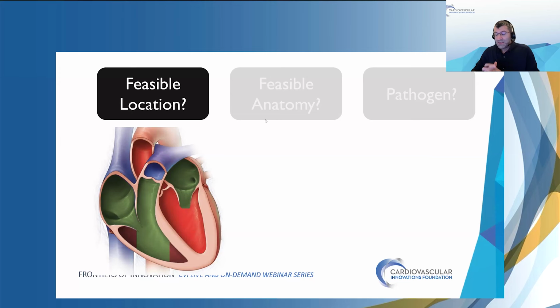Yes, and I would add to that one additional technique, which is actually aspirating on the way back. So sometimes it's hard to get to that subvalvular space in certain situations. So I usually just cross, ramp up the aspiration flows, and pull back and see if that comes off or not. So that's another tip.